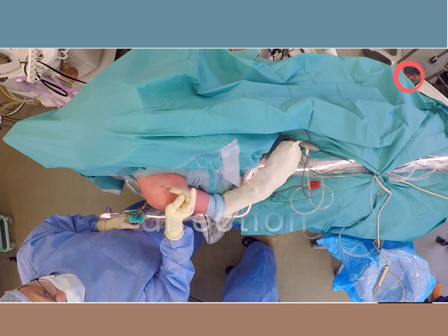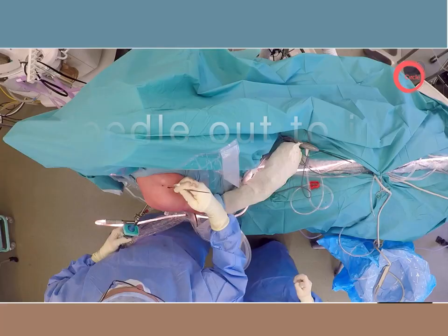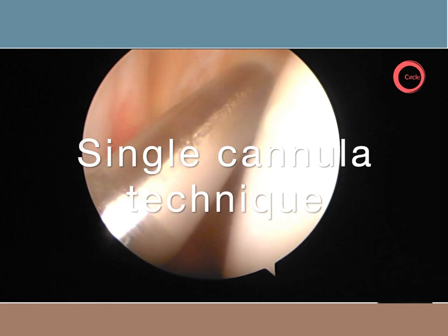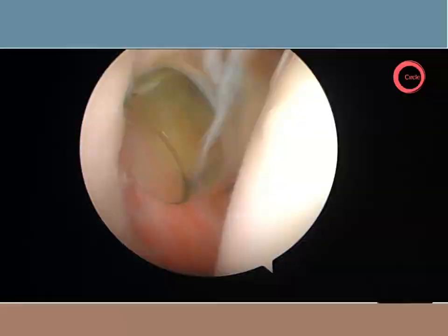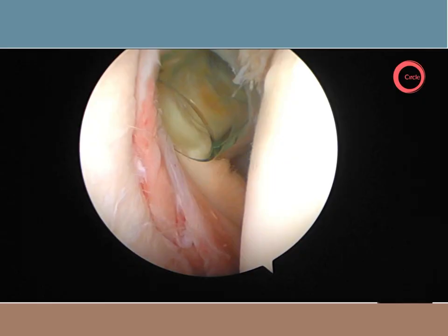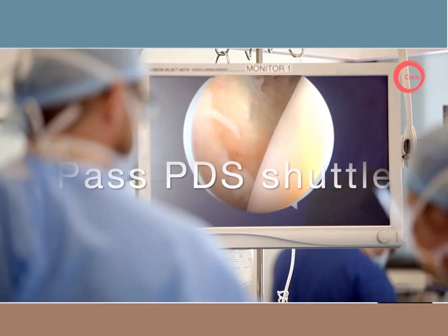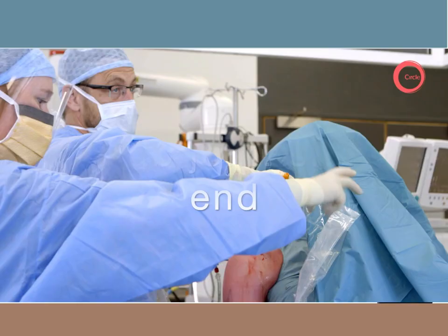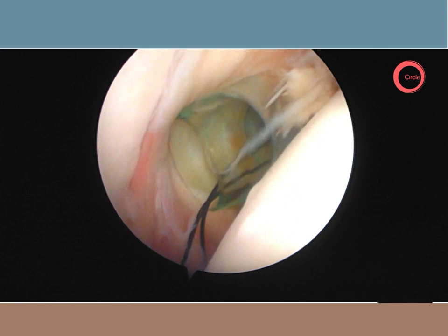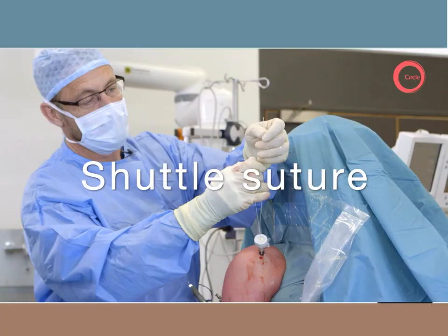For making subsequent portals, I use a spinal needle with an out-to-in technique. This demonstrates not only the ideal site for the skin incision but also the direction for the ideal entry point into the joint and then onto the glenoid. For most cases, I use a single portal technique unless performing a significant capsular shift. It's important to fully mobilise the labrum and rasp the glenoid neck to produce a bleeding bone base to promote good healing of the reattached labrum. I then pass a PDS suture which will be used to shuttle the definitive suture. I then draw the suture up to where I estimate is the correct site for anchor insertion and check the external rotation range to ensure the shoulder will not be over-tightened.